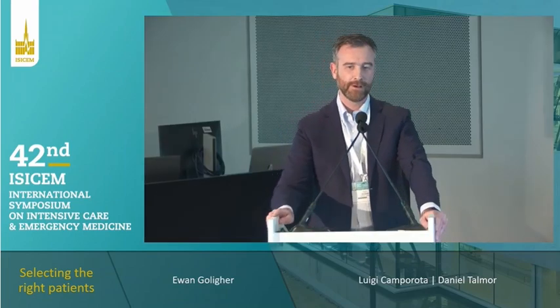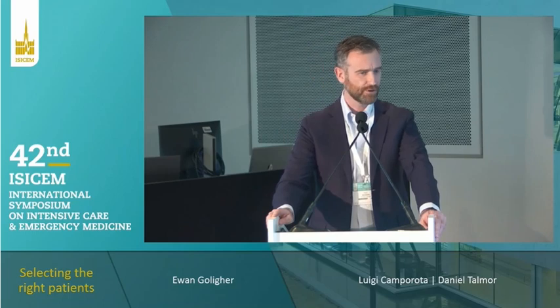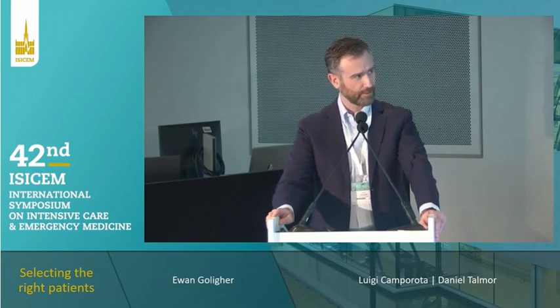Yes, so these are really thoughtful points. With respect to the ventilatory ratio, you're right, that's a fairly high threshold of 3. A relatively small fraction of the population, about 20%, had a value above that. So you're looking at a relatively small fraction. But I think the critical issue is that threshold for benefit would probably be modulated or even lowered if you're using a higher flow system where you can achieve greater CO2 removal.